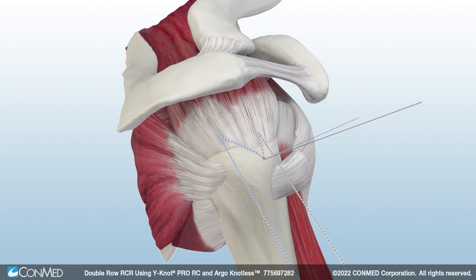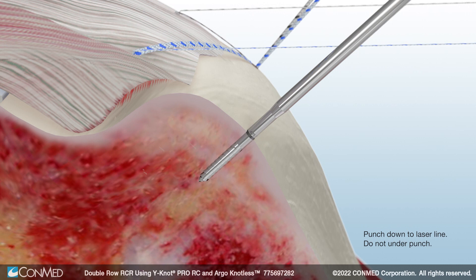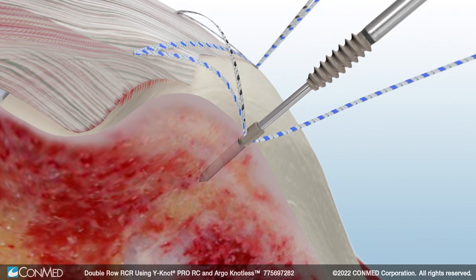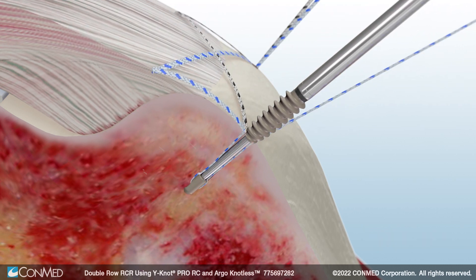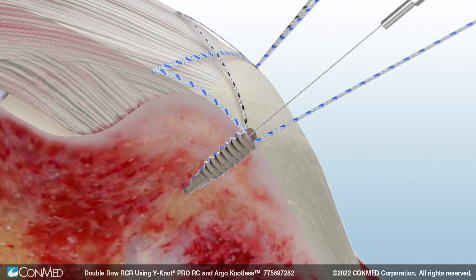Then insert the Argo-Knotless broaching punch to create the posterior lateral pilot hole. Load and tension the Hi-Fi Ribbon's suture limbs. With Argo-Knotless Smart Tension technology, the suture cleat maintains tension as the anchor is inserted, preventing the repair from being over-tensioned.